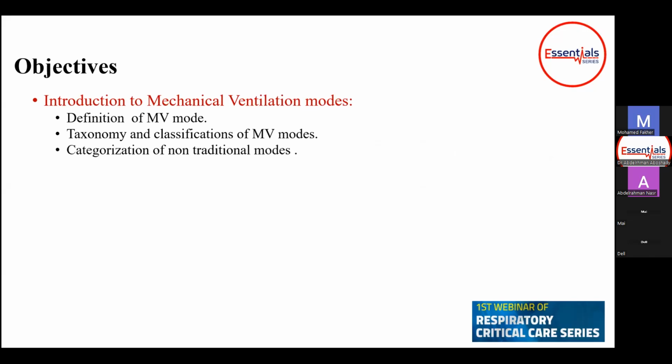Last, we will talk about the categorization of the non-traditional modes. We all use the conventional modes: volume control mode, pressure control mode, SIMV, and the spontaneous mode. These four modes have been established in our practice since the 1980s. Yet, since the 1990s till date, there have been many modes in the market. So we are going to categorize them in clusters that look like each other. That's the first objective of our session, an introduction to the mechanical ventilation mode.